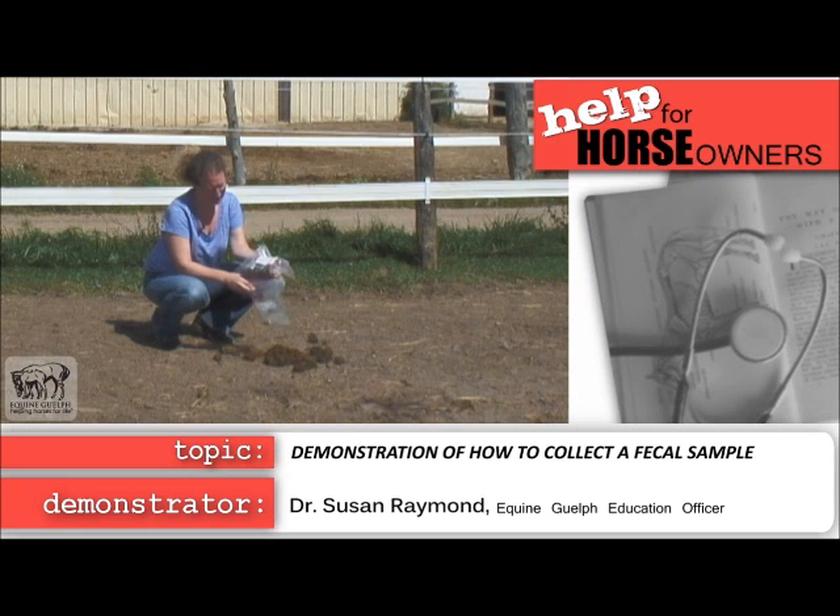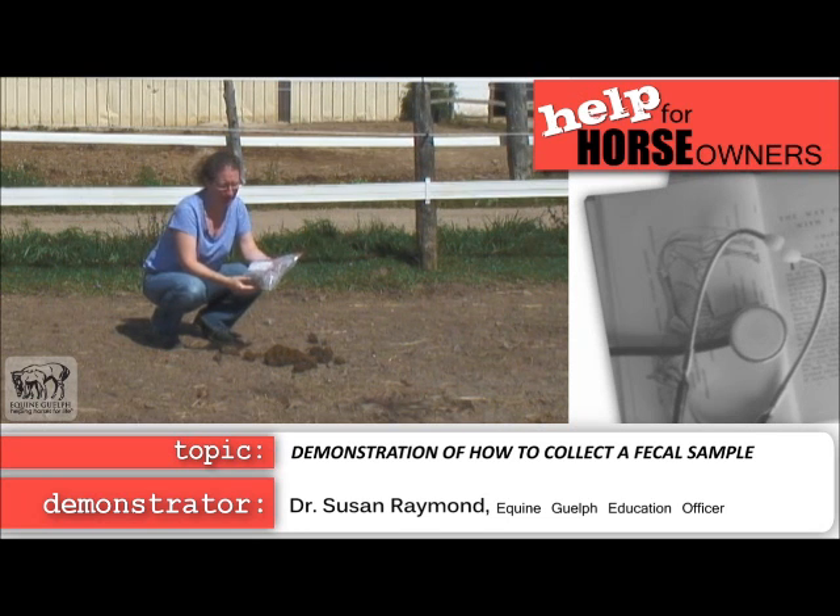Put your sample bag into the second bag and close it — now you have your sample ready. It's best to get your sample to the lab within 48 hours, and be careful of storage: don't freeze it.